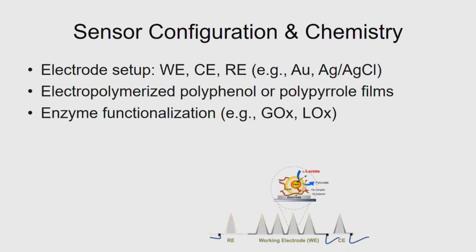So you need very thin conformal layers. You need to have the functionality of your bioreceptor maintained. And how can you maintain that? By having films that are conformal. For example, electropolymerized polyphenols, electropolymerized polypyrrole films. The reason we use these is because these do not grow beyond 50 nanometers. I have done studies wherein I used epoxy polyurethane membrane, thinking that it will help me in reducing any interference. And I found that when I would push it into the skin, right, and take it back and do an SEM under the lab, the membrane would be completely torn.